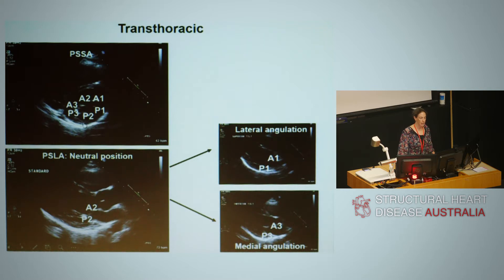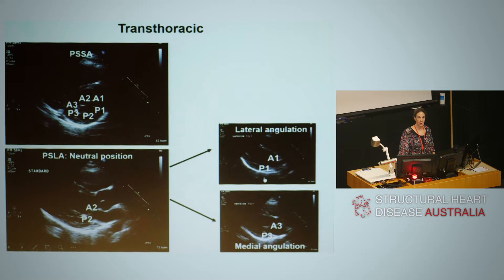We can look in parasternal long axis in the neutral position, and here we can see the central segments, A2 and P2. If we use this image and tilt superiorly, we'll angulate towards the anterolateral commissure and can see A1 and P1. From the neutral position, if we tilt inferiorly, we will see A3, P3, interrogating the medial aspect of the valve.